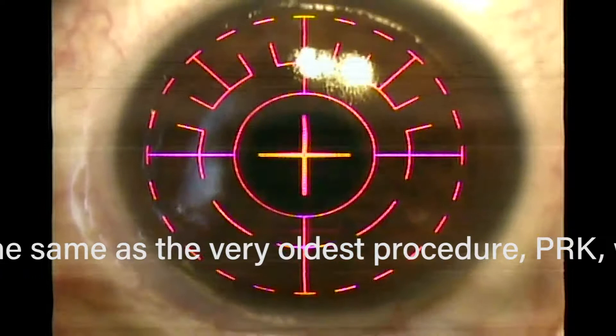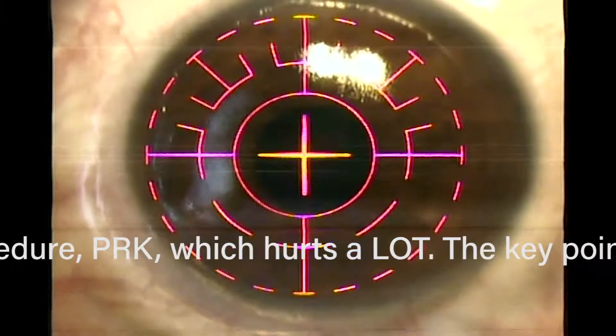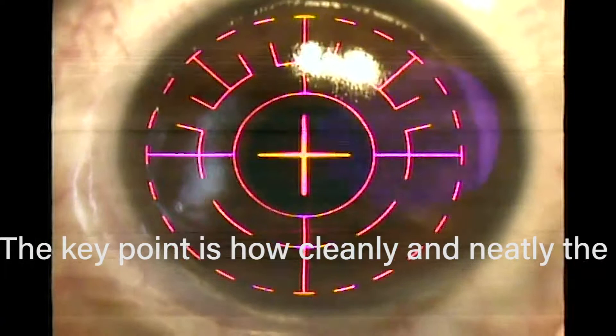It takes about 10 seconds per diopter. So if your prescription is, say, minus 2.5, it's going to take about 20 seconds. And that's pretty much the description of Epi-LASEK.